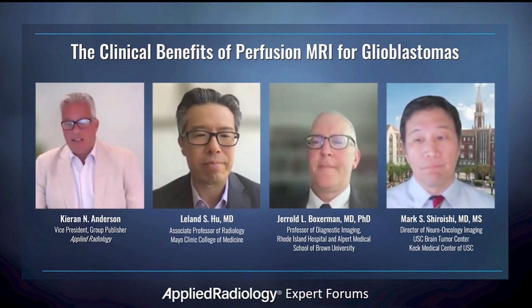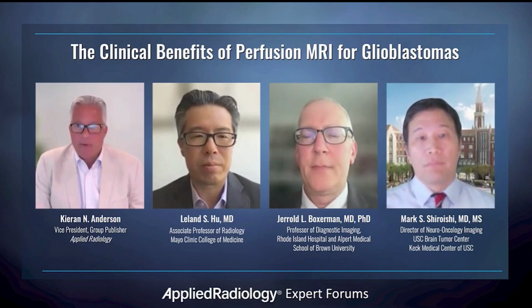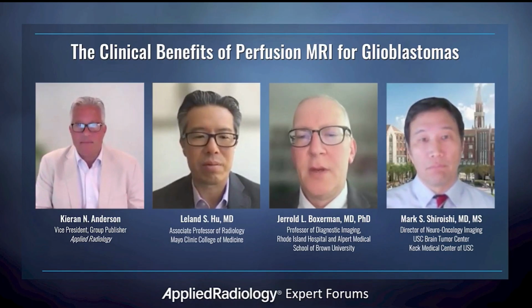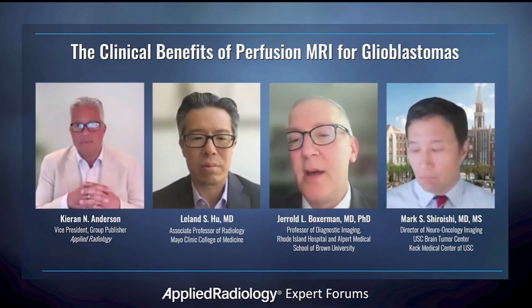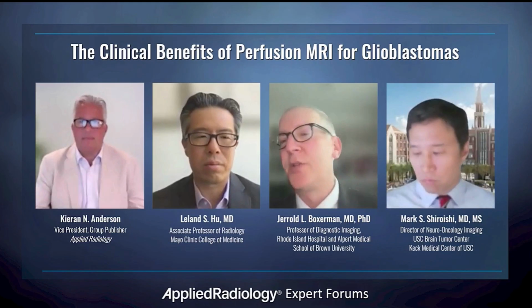Thank you for addressing that, Dr. Hu. Another question popped in here, a pretty basic one, probably a quick answer. Is perfusion MRI safe? Maybe you, Dr. Boxerman, could take that? Sure. So I think it's important to remember that perfusion MRI, DSC MRI, uses the same contrast injection that we administer for conventional post-contrast imaging.